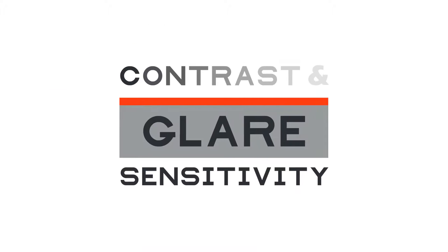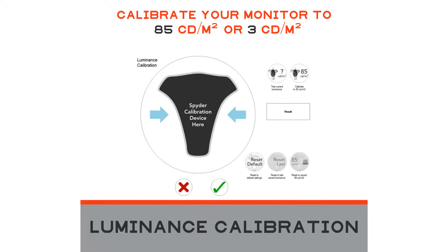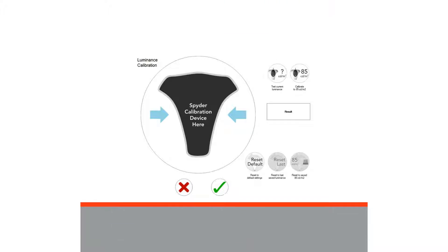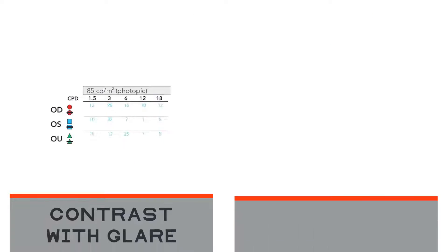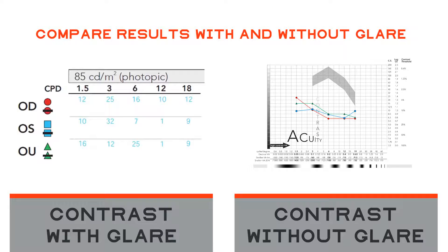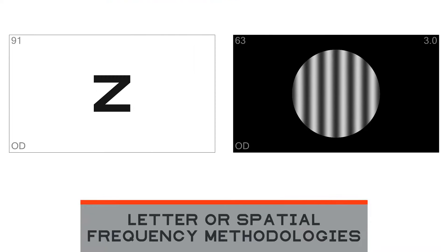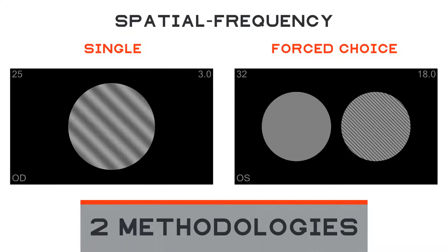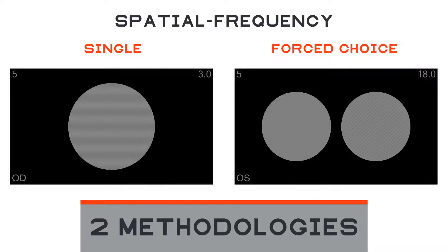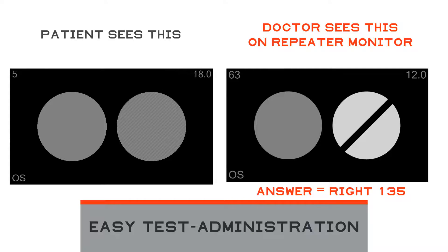Unique contrast sensitivity and glare disability testing, with a luminance calibrator for standardized outcomes. Test contrast under glare and use the report to compare contrast with and without glare. Test using letters or spatial frequency. Spatial frequency is tested with single or dual targets, while you see the correct results on the repeater monitor.